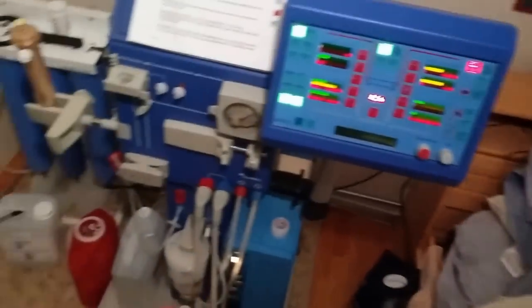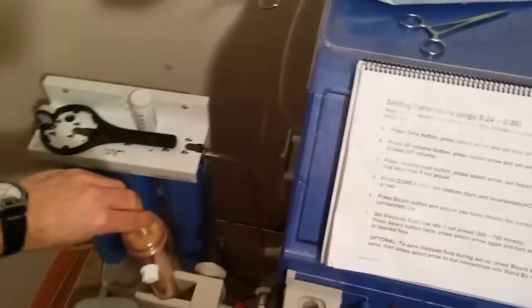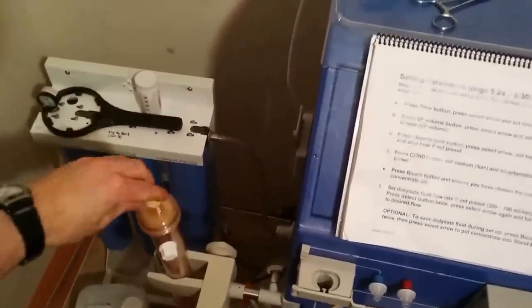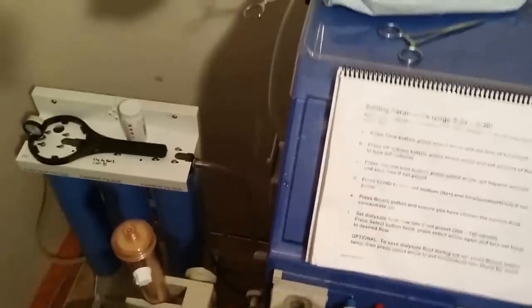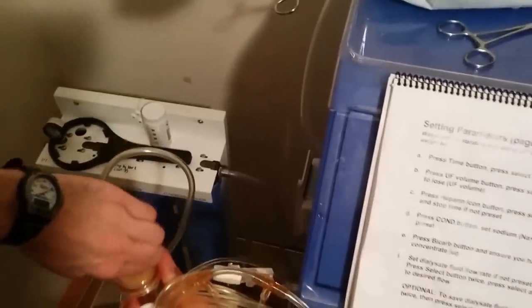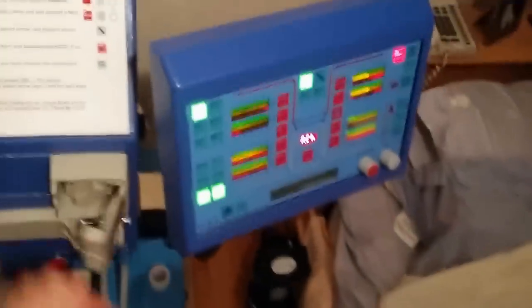Since we're dealing with a sterile setup, I have isogel, antibacterial, just to wash and clean up my hands beforehand. We start with the arterial line, which is the red line, and we're going to connect that to the dialyzer first. The endpoints we don't want to actually touch with our hands — we want to make sure we're not physically touching anything that is part of the sterile circuit.